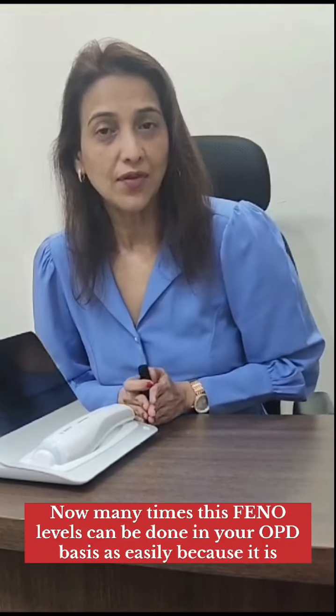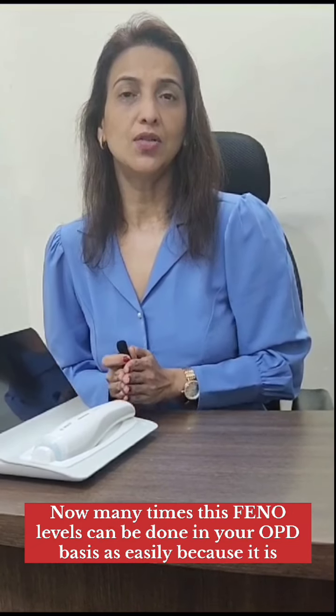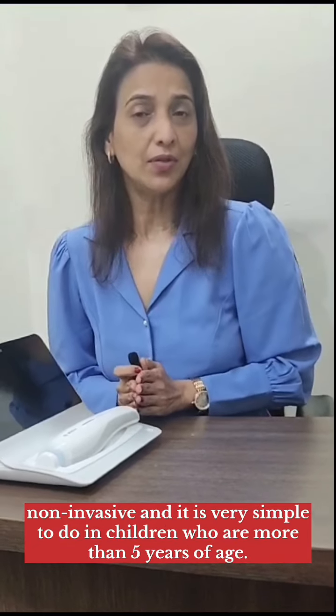Now, many times these FENO levels can be done on an OPD basis as it is non-invasive and very simple to do in children who are more than 5 years of age.